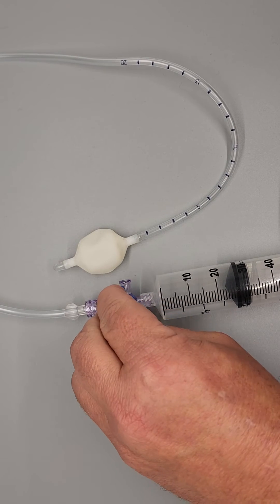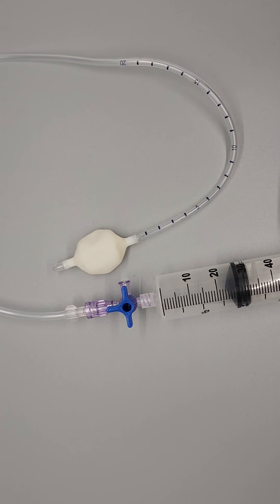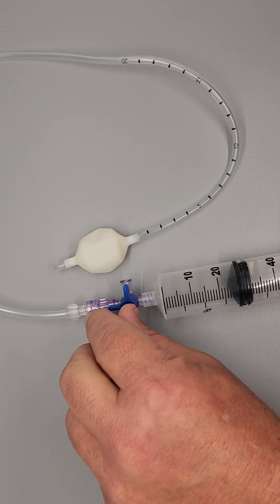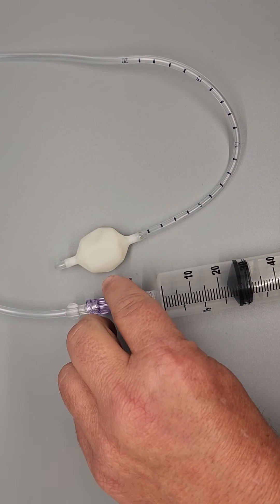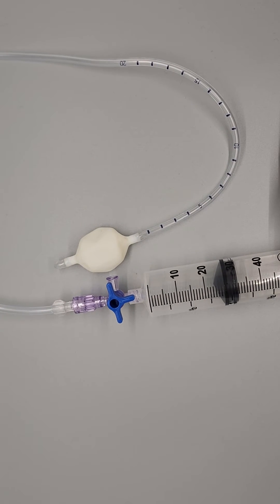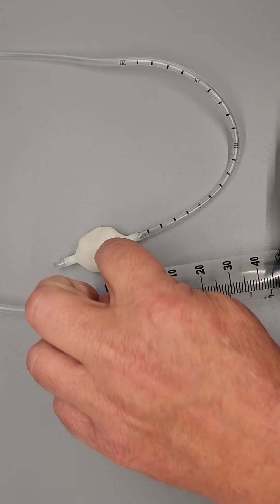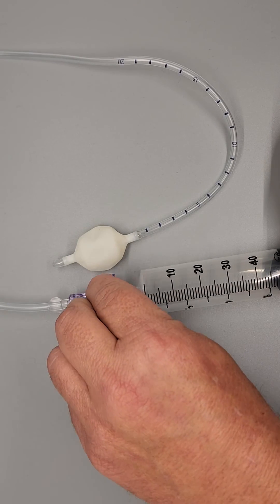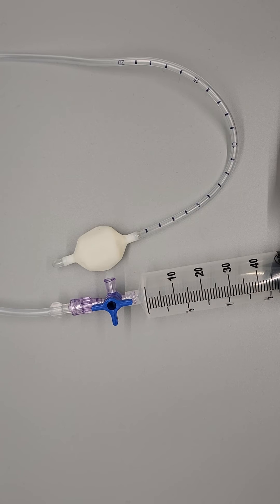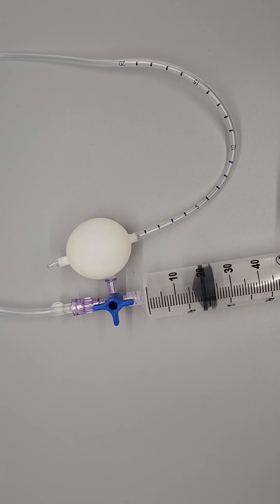And if I have it turned here, I'm blocking off the syringe. So, if I want to fill the syringe so that I can fill the balloon, the first thing I'll do is turn my blocker over to the catheter. Now I'm able to draw in air through this side port, and now I'm going to block this side port with my flat end. And now as you can see, as I push, I can expand the balloon.